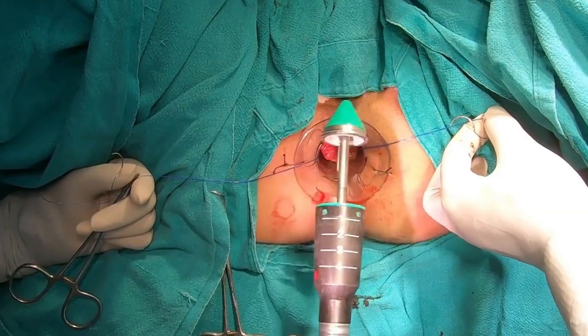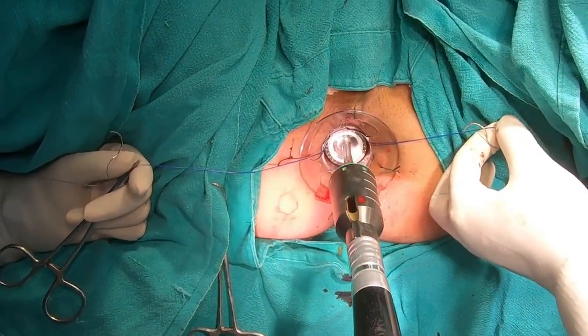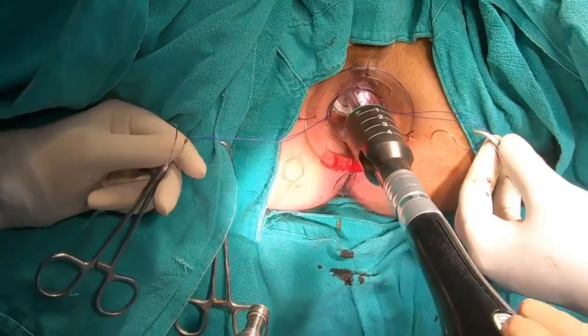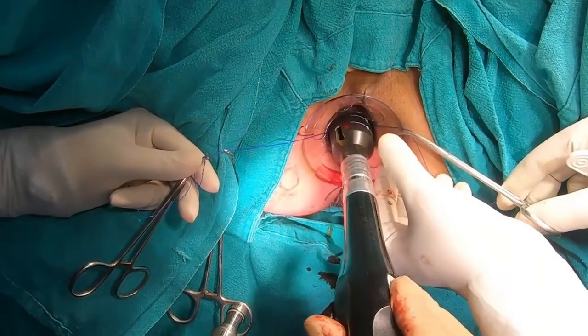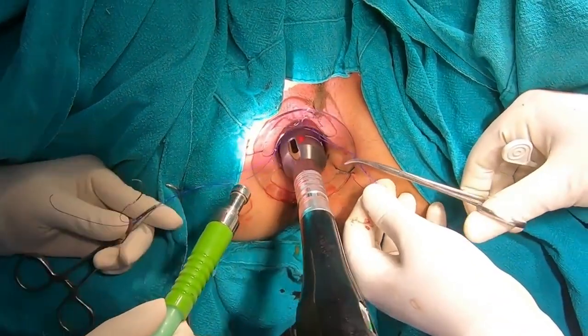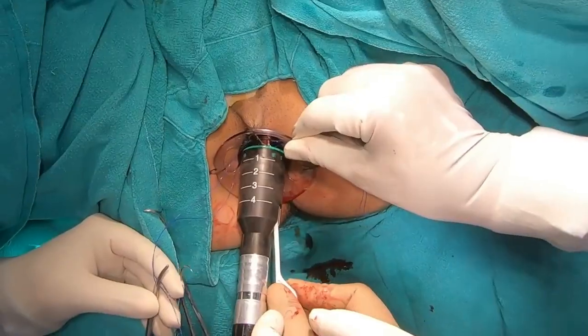There are other methods that use devices for treating hemorrhoids, such as PPH. With the use of the PPH stapler, we actually go to a higher area to place the hemorrhoidal tissue within the jaws of the PPH device. We position the mucosa in such a way that it enters the jaws of the PPH, and about 2 to 3 centimeters of mucosa above the dentate line above the hemorrhoidal pads is actually removed.